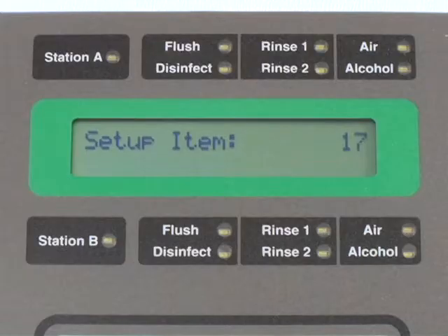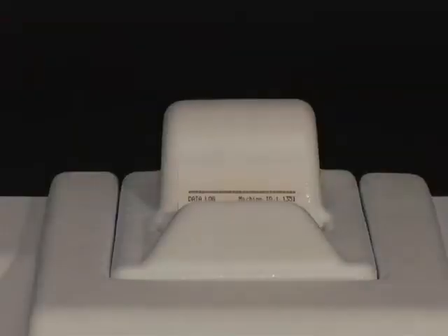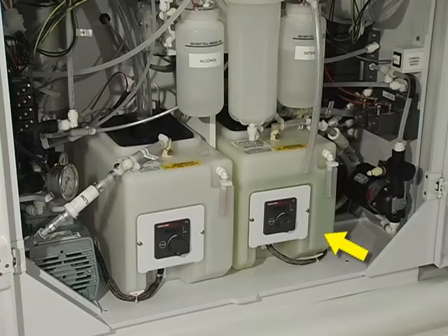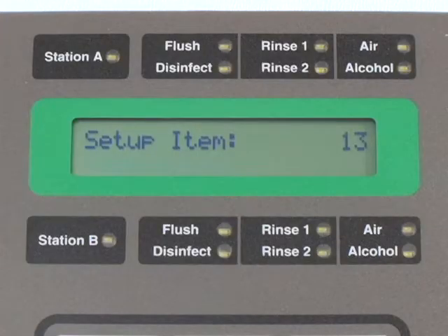After the cycle is complete, a message will print out. At this time, proceed to add approximately one gallon of disinfectant to the Station B reservoir to complete the water line treatment. If using a heated disinfectant, allow it to heat to the appropriate temperature, which can be verified by entering setup function 13 and viewing the display.